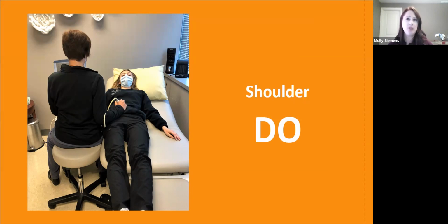So for these patients, we do have a few options. One would be to scan what you can from one side of the patient's bed, and then move the entire machine to the opposite side to obtain the rest of the necessary images. This was something, again, that was recommended in the literature, but it can be quite time consuming and may not be technically feasible depending on the size and the layout of the patient's room.